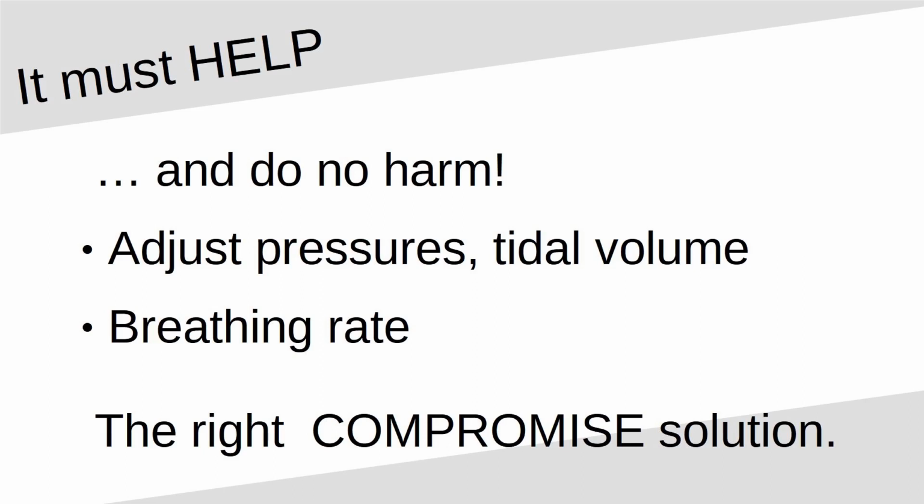and pressures as presented to the patient. They need to be adjusted on a per person basis, apparently, by the medical professionals. The other thing that, of course, you need to be able to adjust is the breathing rate. That is all critical, again, based on the person and their particular situation.